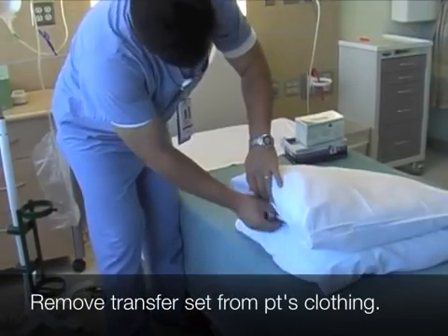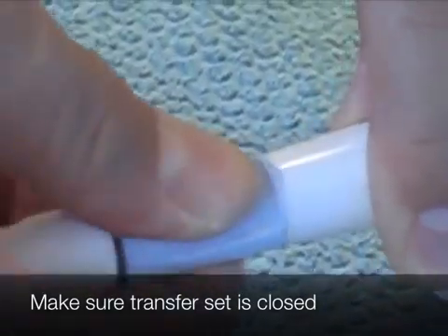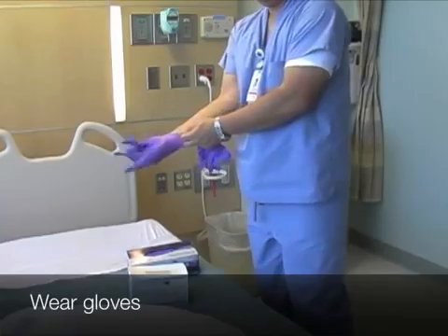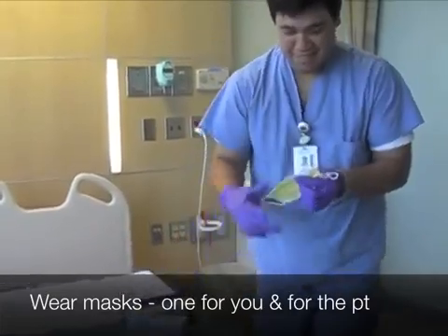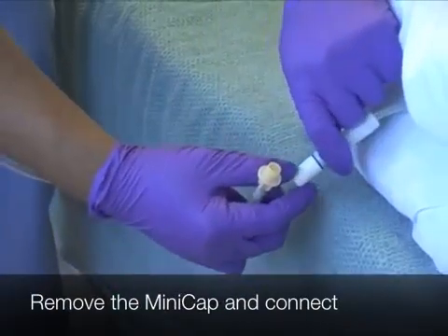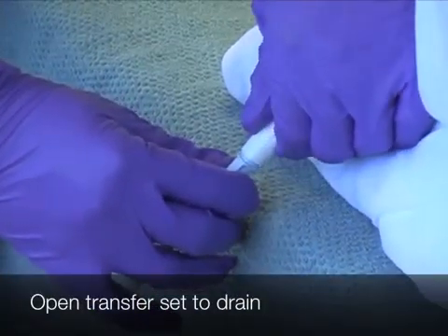Remove transfer set from patient's clothing. Make sure the transfer set is closed. Wash your hands thoroughly. Wear gloves. Wear mask, one for you and for the patient. Remove the pull ring from the ultra bag. Remove the mini cap and connect. Open transfer set to drain.